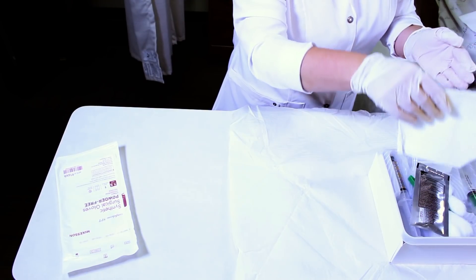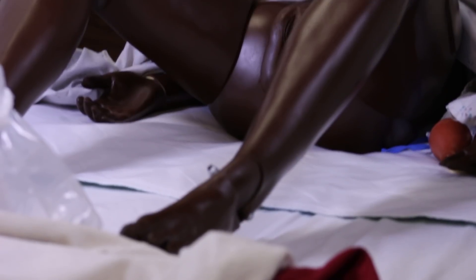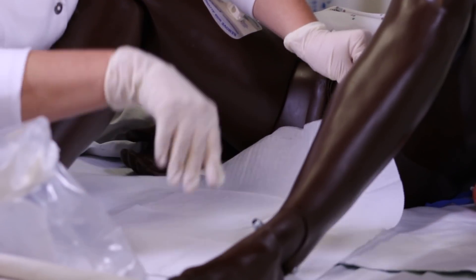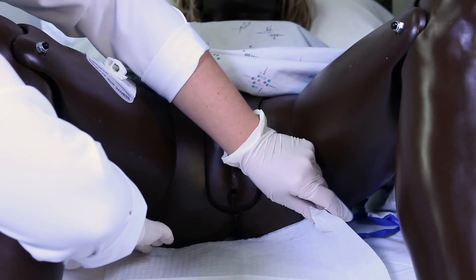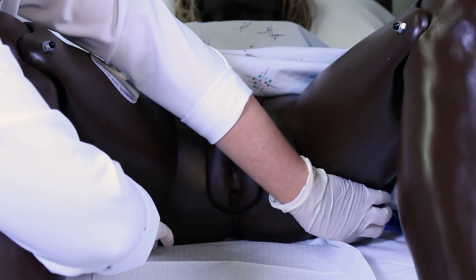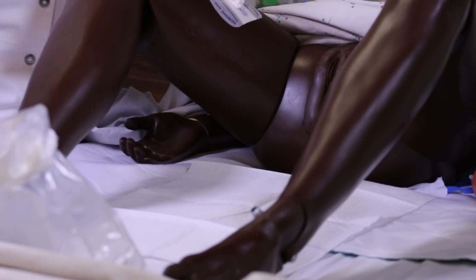Now here we have a drape. I'm going to take the drape, being careful to reach just on the edge, and put it between the legs and the peri area of our patient, keeping in mind that the one-inch section around the drape is not sterile.